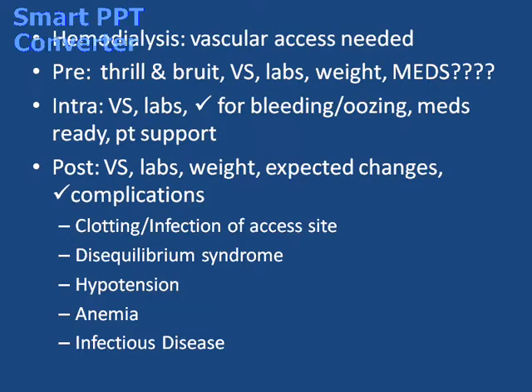We want to make sure that blood pressures are not taken on the arm that has the access site, that they are not getting any injections on that site, venipunctures are not being done, and there are no IVs on that side. That side is sacred. We're trying to preserve that site.